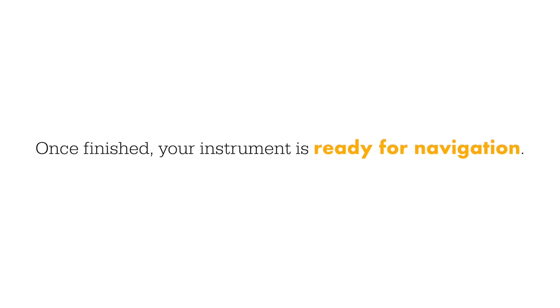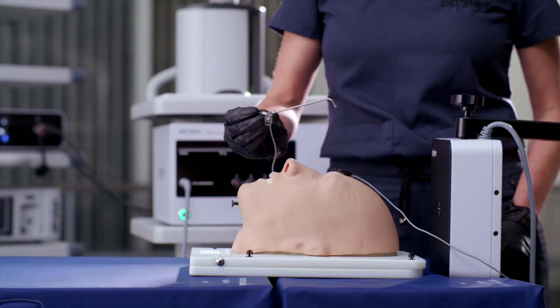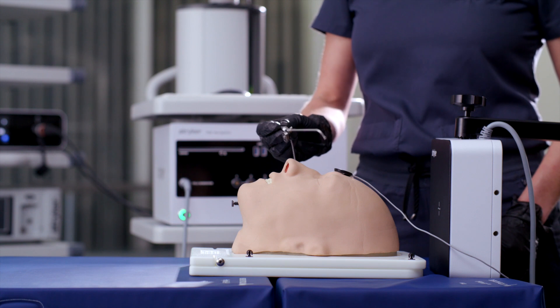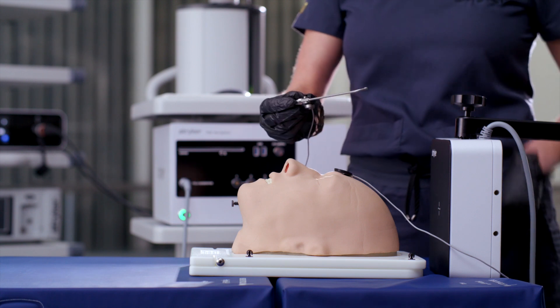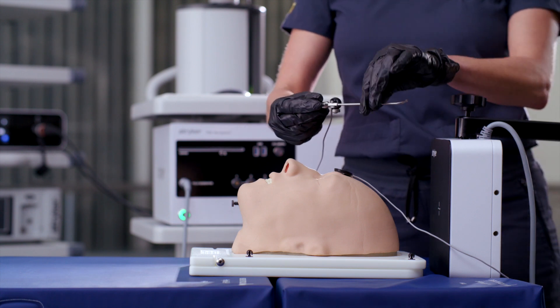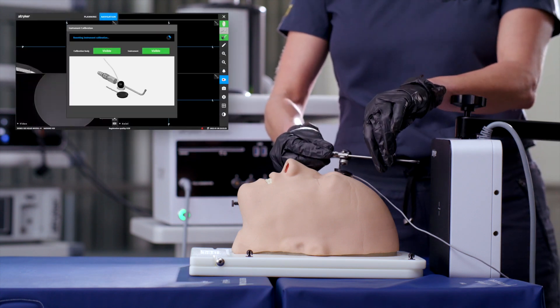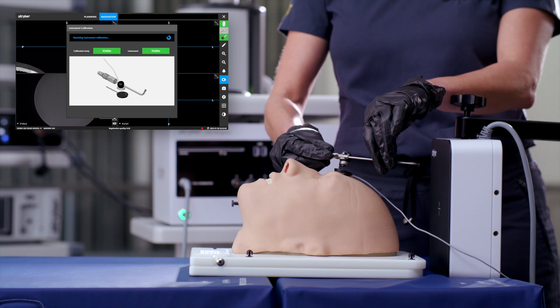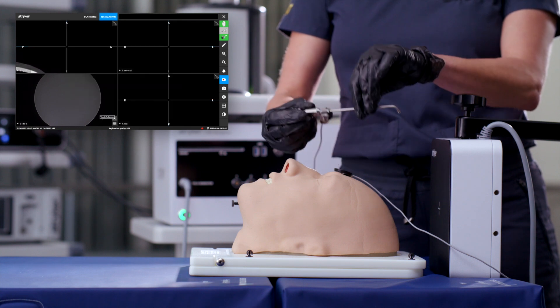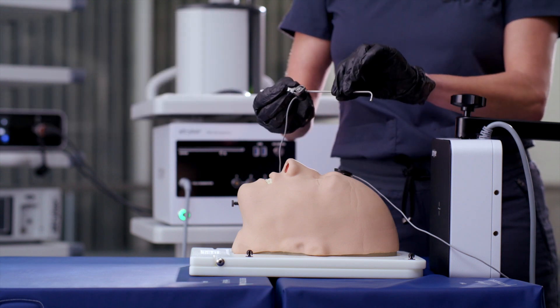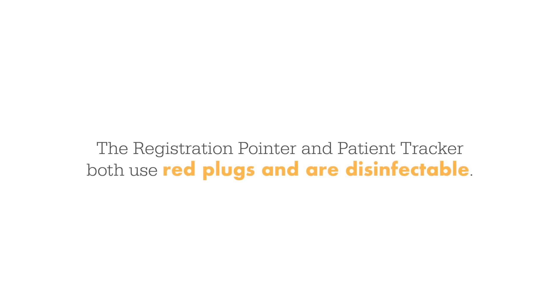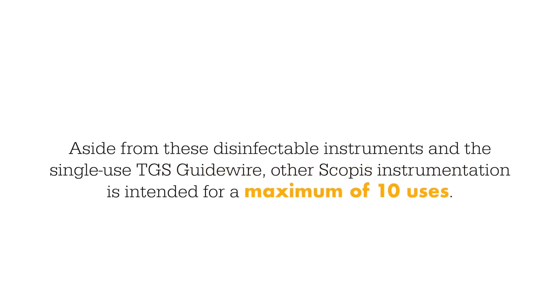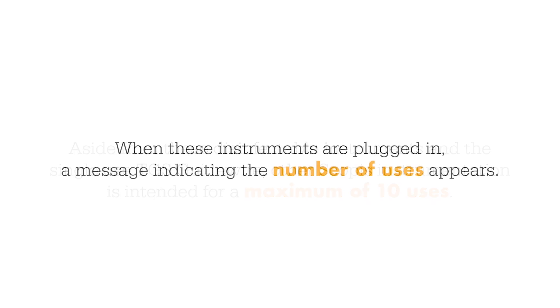If you want to use the same clamp on a different instrument or if the clamp moved during the procedure, you can reset the calibration by holding it upside down over the patient tracker to open the reset dialog. The registration pointer and patient tracker both use red plugs and are disinfectable. Aside from these disinfectable instruments and the single-use TGS guide wire, other Scopus instrumentation is intended for a maximum of 10 uses. When these instruments are plugged in, a message indicating the number of uses appears.